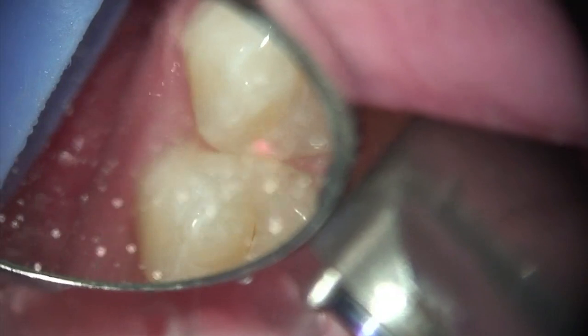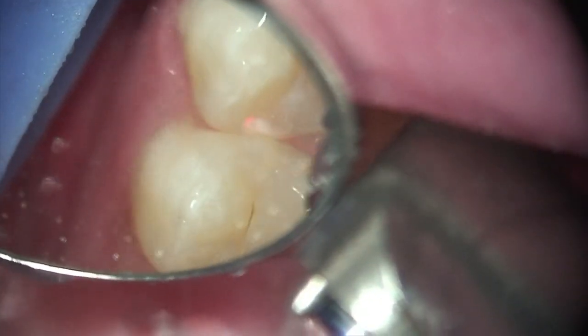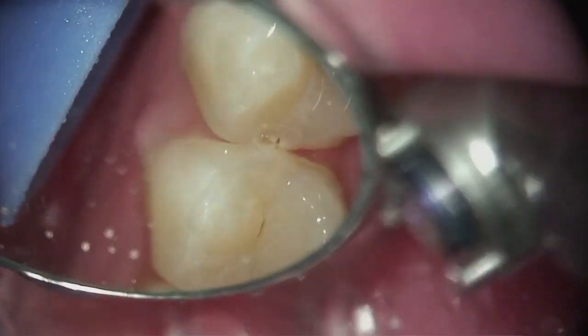You'll see I'll expose the decalcified tooth structure and the decay — the small, minimal amount of decay that is present in the proximal box. Also notice I have not affected the adjacent tooth.